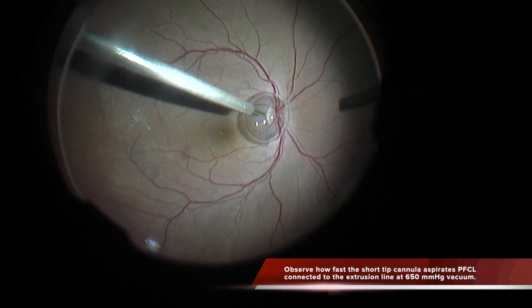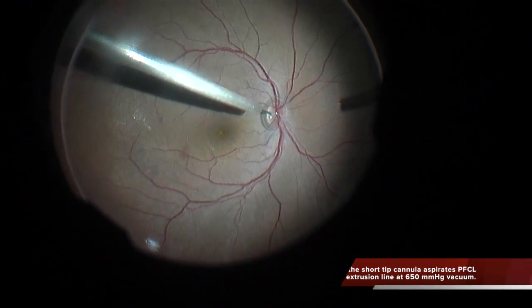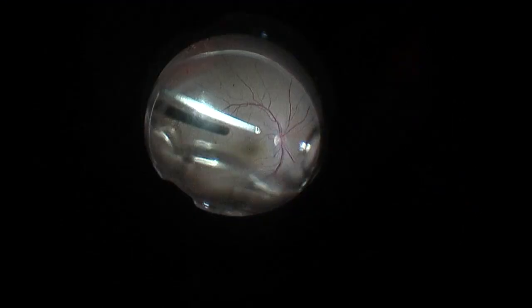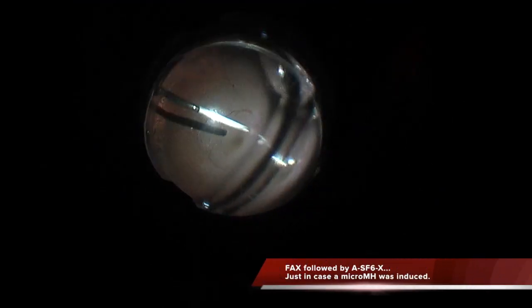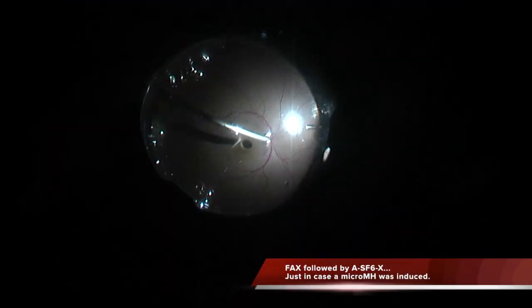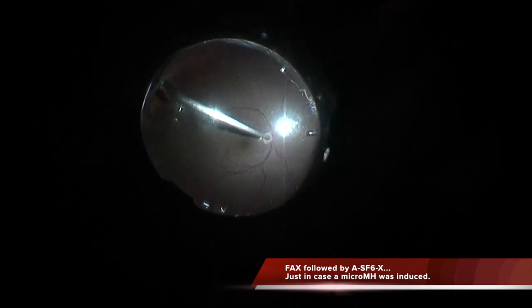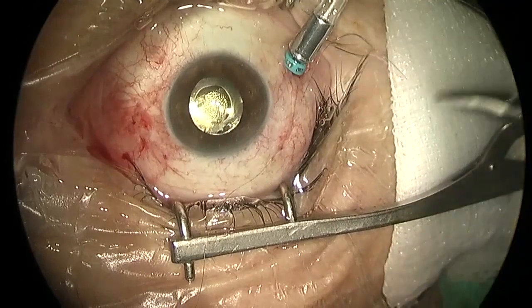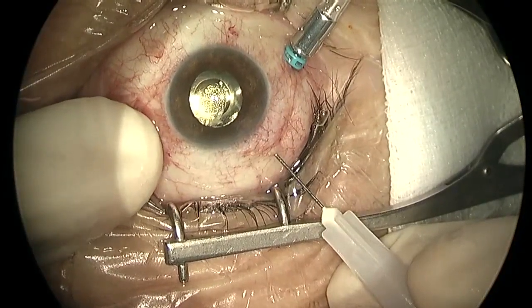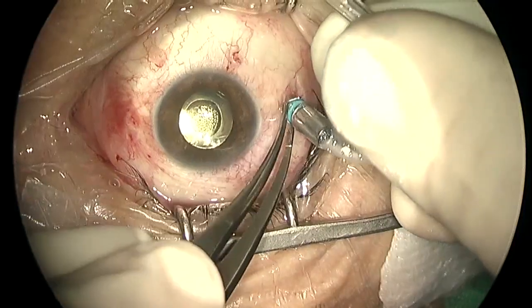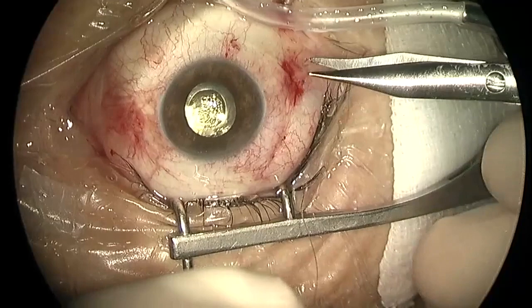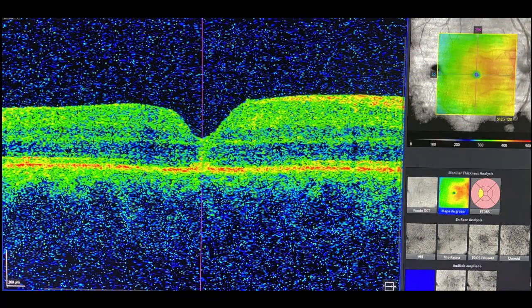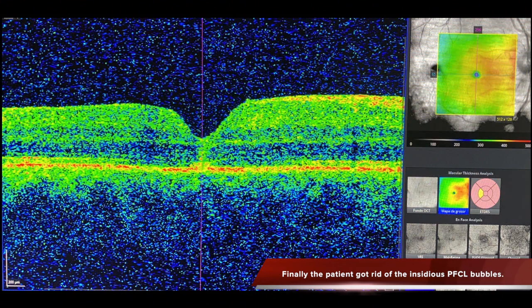You can see how well these short tip MED1 cannulas can aspirate PFCL. The fovea was clean and then we performed a fluid-air-gas exchange in order to treat a likely micro macular hole. In this case we were successful and the subretinal bubbles were completely removed without RPE damage.